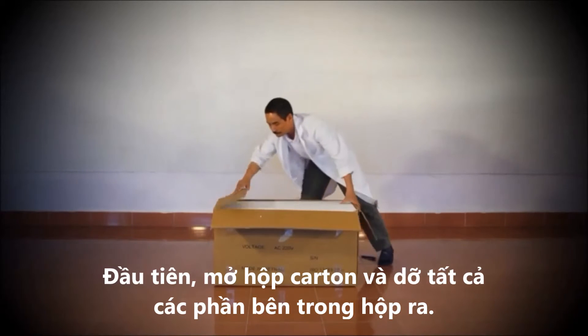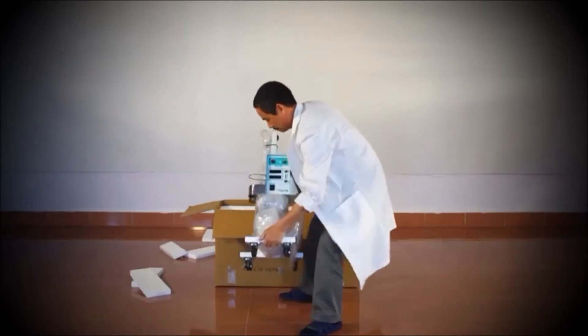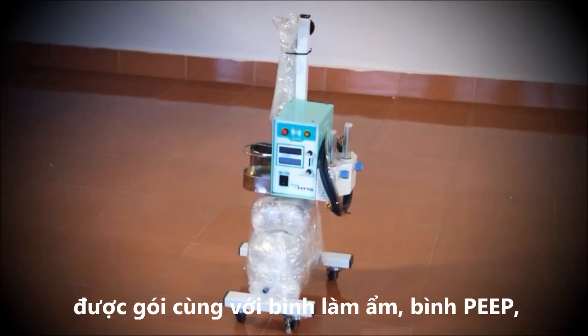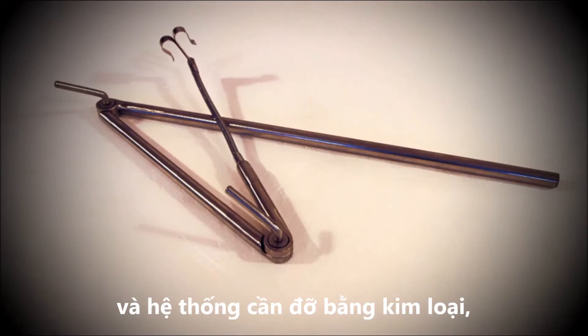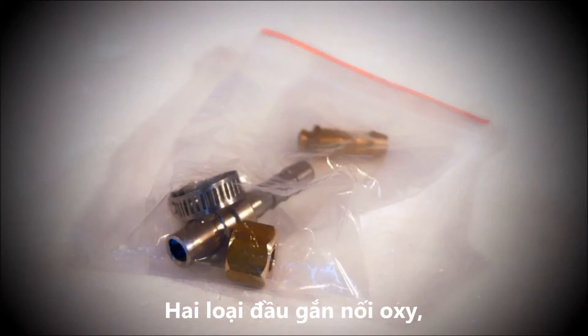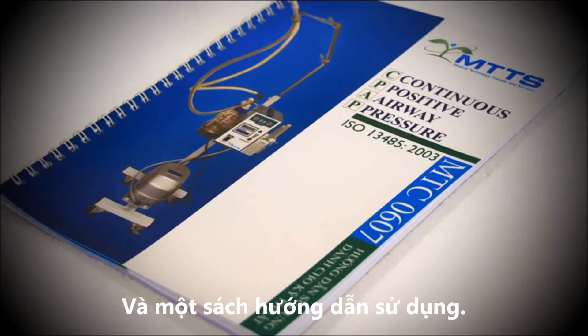First, open the box and remove all the components. You should have the CPAP main unit with control box and blender, which are packed together with the humidifier bottle and the PEEP bottle and the CPAP arm. Two patient circuits which include silicon tubing and heater wires. Two types of oxygen connectors. A sample nasal cannula and a user manual.